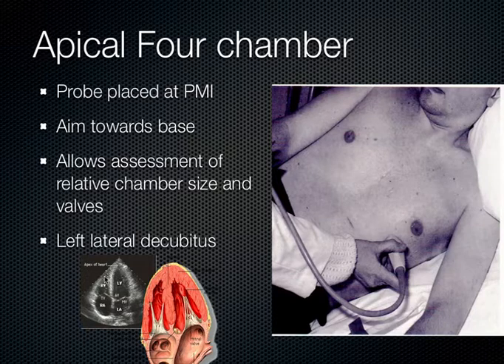As the right ventricle gets bigger and bigger, there could be problems, with the right ventricle trying to pump blood against an obstruction like a pulmonary embolism. In the setting of massive pulmonary embolism, or blood clot in the lung, the right ventricle gets so big it approximates the size of the left ventricle. So that's how I use this view clinically.